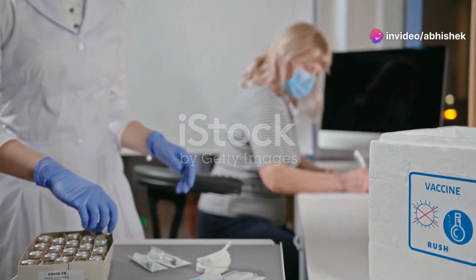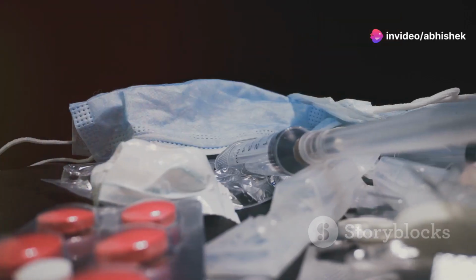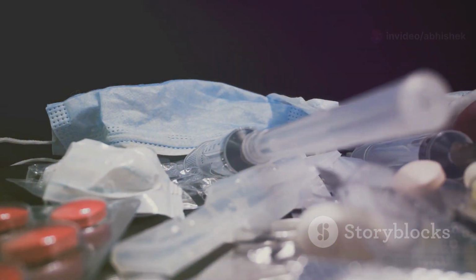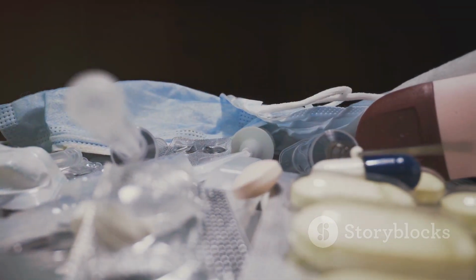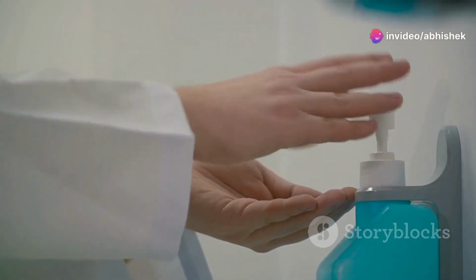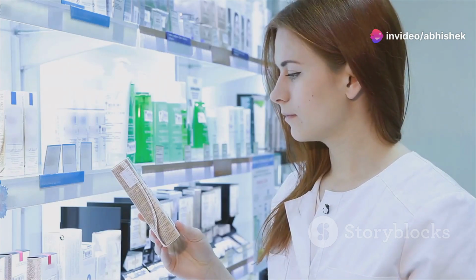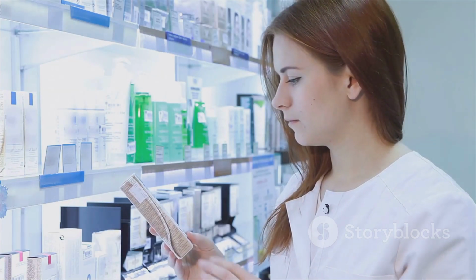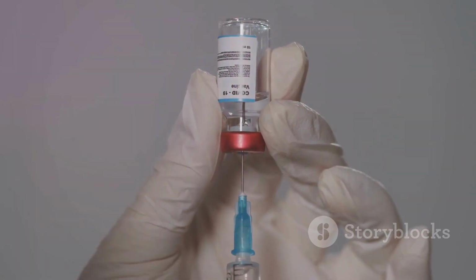Step-by-step injection procedure. Administering an injection involves several steps. First, preparation. Gather all necessary equipment, including the medication, syringe, needle, alcohol swabs, and gloves. Next, hand hygiene. Wash hands thoroughly with soap and water or use an alcohol-based hand sanitizer. Then medication preparation. Check the medication label, expiry date, and dosage. Draw up the correct amount of medication into the syringe.